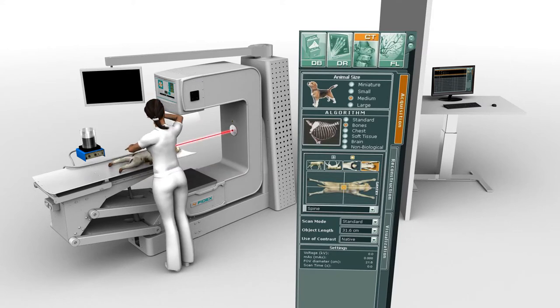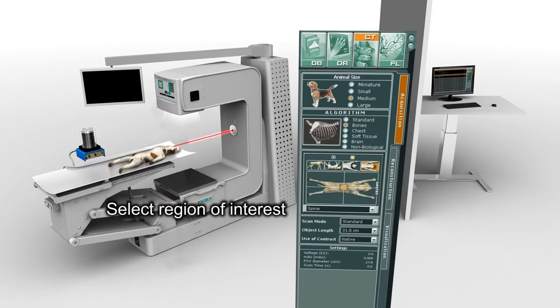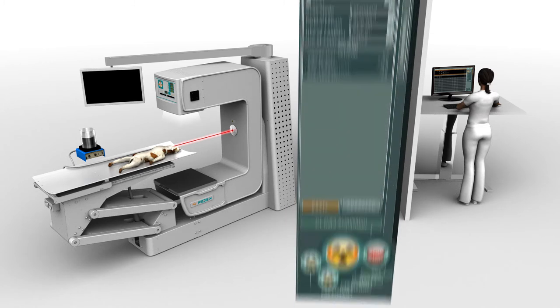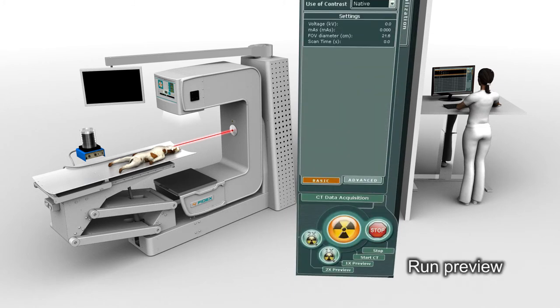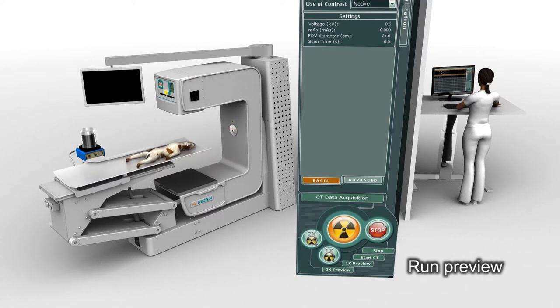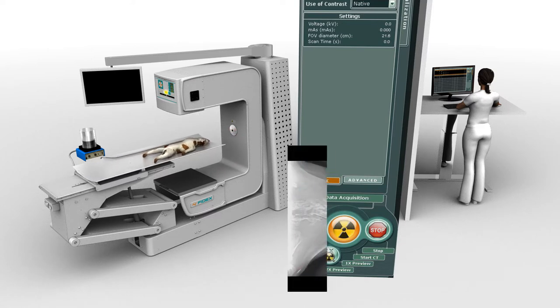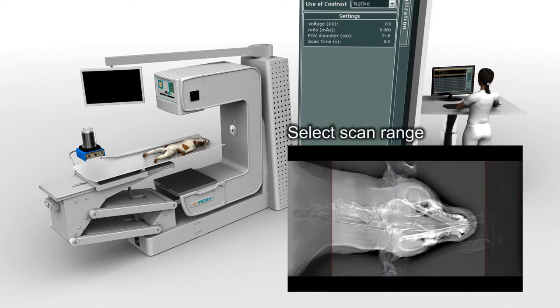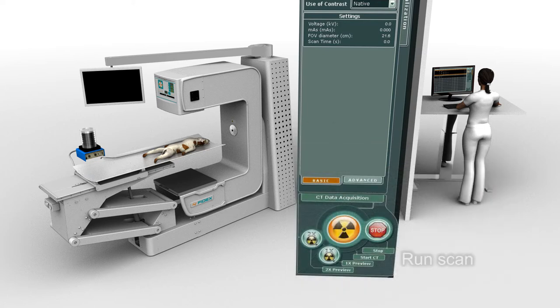Now select the region of interest and verify the center of rotation relative to the region of interest. Run a preview for the CT study. From the displayed preview results, adjust the vertical red lines as shown to select the desired scan range, and then start the CT study.